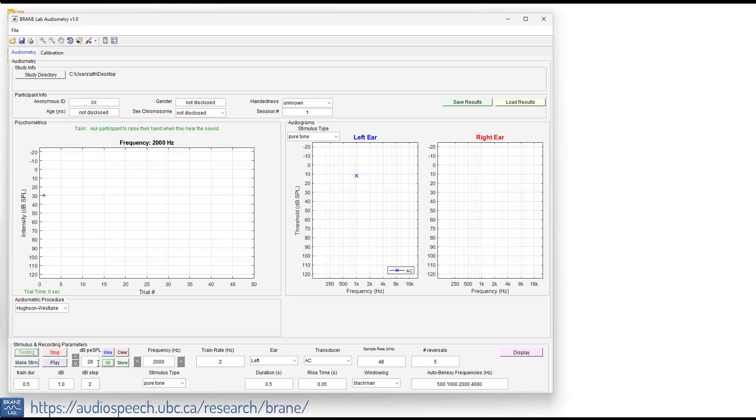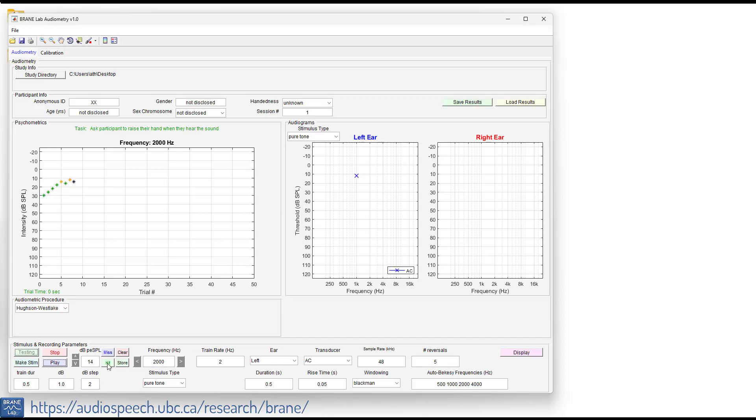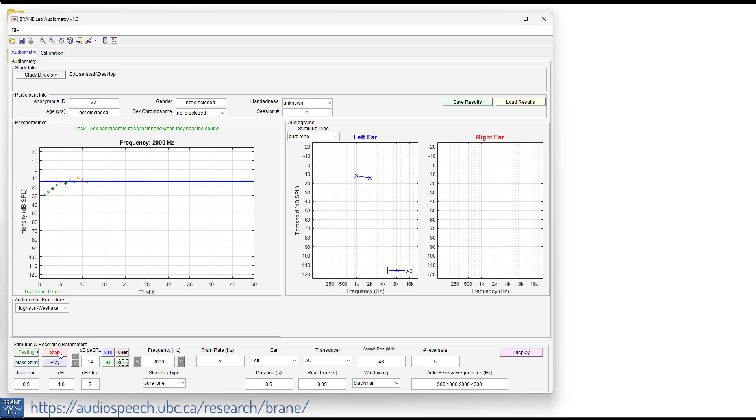I heard that. No, I didn't hear that one. Yep. Yep. I heard that one. So we hit store and then stop. Just a minute to take that threshold there at 14 dB.